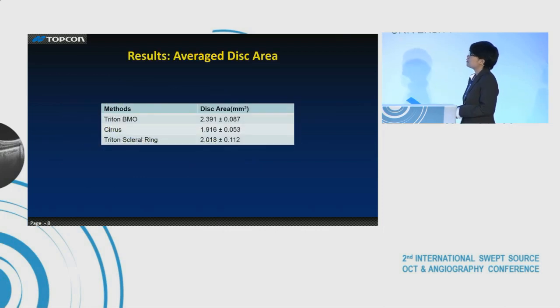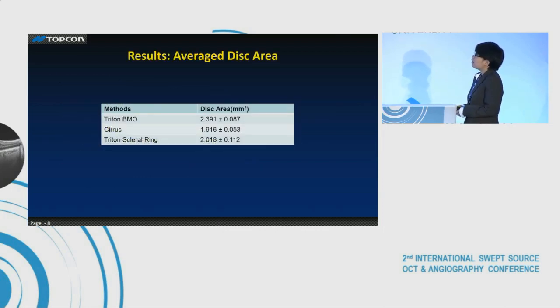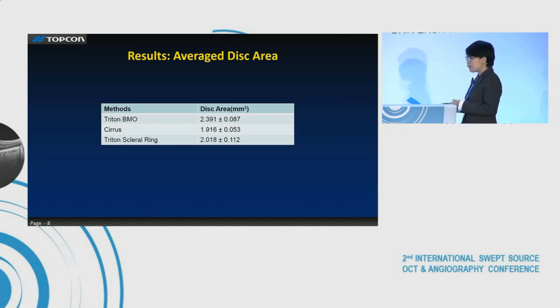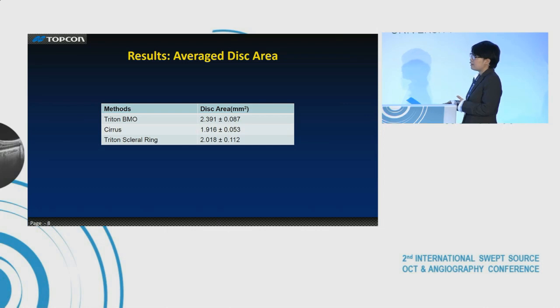Here are the results for the average disk area. Trident BMO has the largest disk area, whereas Cirrus BMO has the smallest disk area. Cirrus BMO is more closely aligned with Trident scleral ring than with Trident BMO.